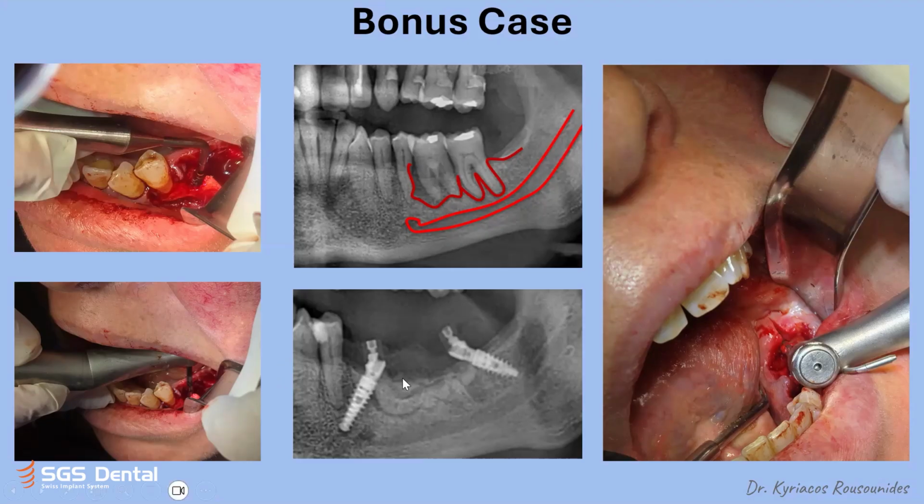I didn't want to have any defect, especially on the threads of this implant, and afterwards in the final prosthetics. It's actually a very fresh case, very new. We did this last month, and we placed a collagen sponge on the bone, augmentation material in the middle, a collagen sponge, which is why you see these lines, and above another layer of bone.